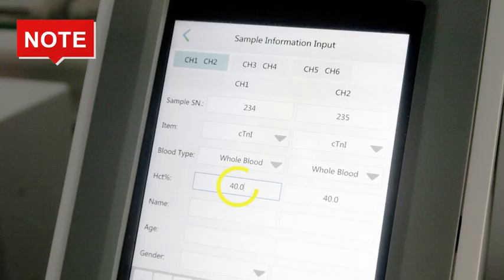Note, the instrument automatically checks the sample type, whole blood or other. For whole blood samples, the HCT percentage can be manually added and the default value is 40.